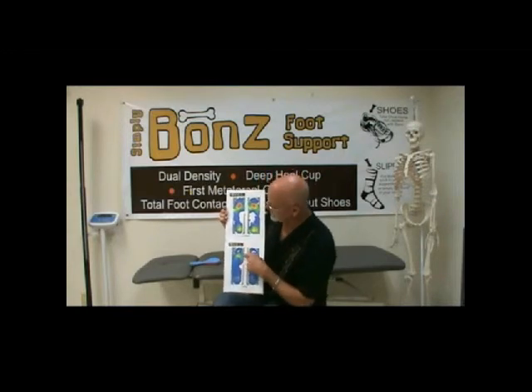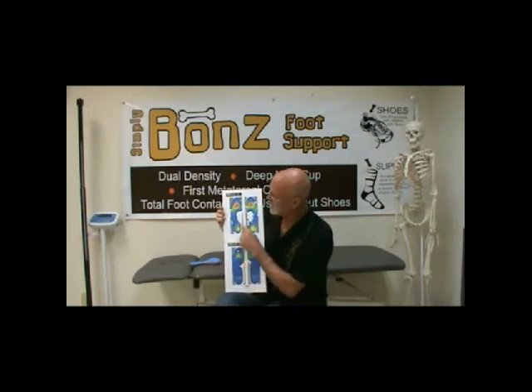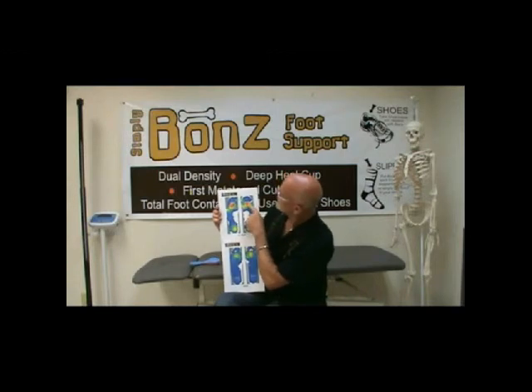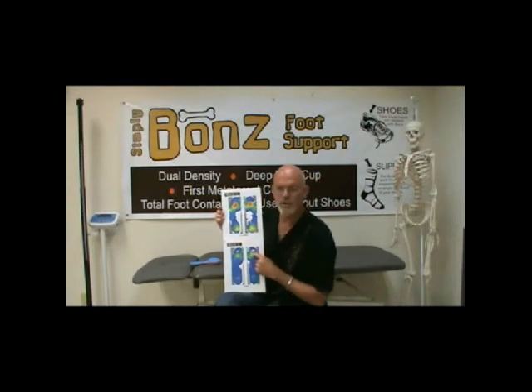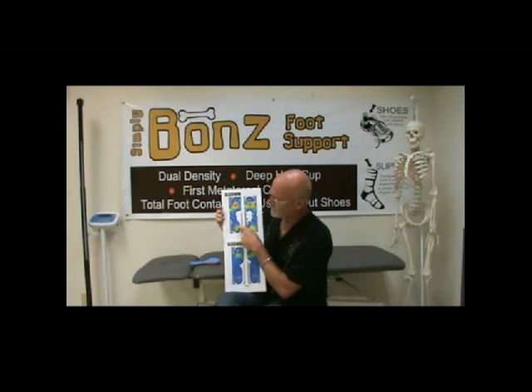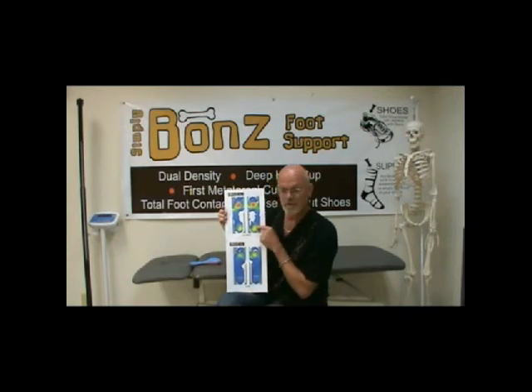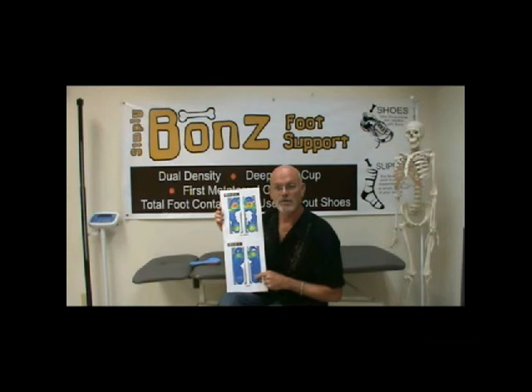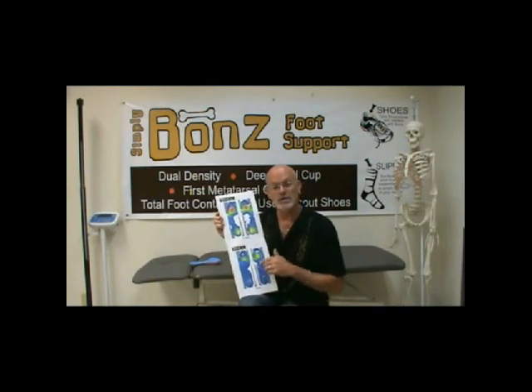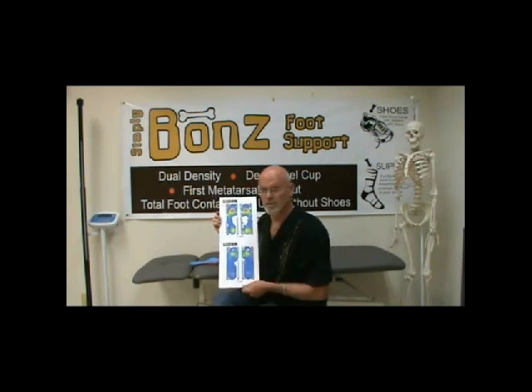Okay, so in this case, this person went from 61 psi to 48 psi in the ball of their right foot. They went from 53 psi to 48 psi on this side. But more dramatically, what happens in the heel is that this person went from 35 psi down to 19 on the left side, and from 38 psi down to 19 on the right side. So this is just a matter of spreading that force out over a larger area. Pressures naturally go down. It's simple physics.